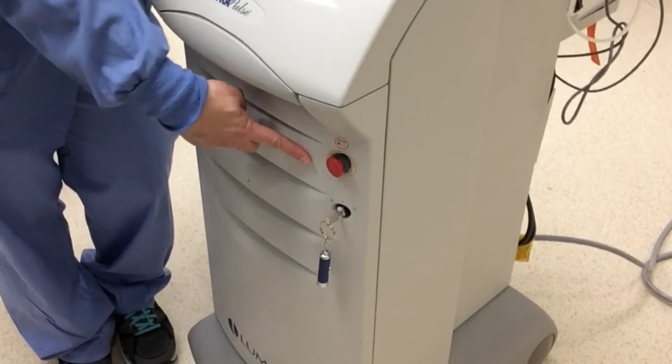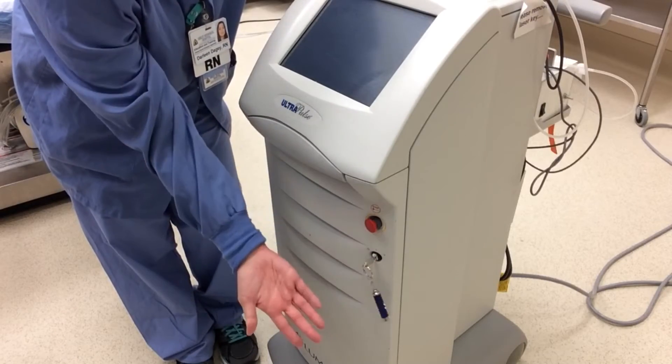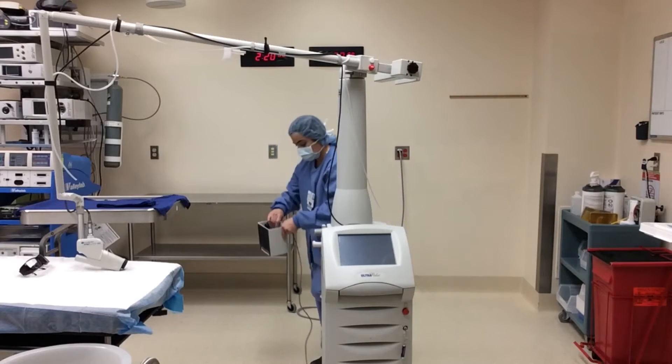Now you are ready to turn on the laser. The red button is an emergency shutoff. Turn the key to the right like a car key to turn on the machine. The pedal to activate the laser is kept in the back of the laser machine.